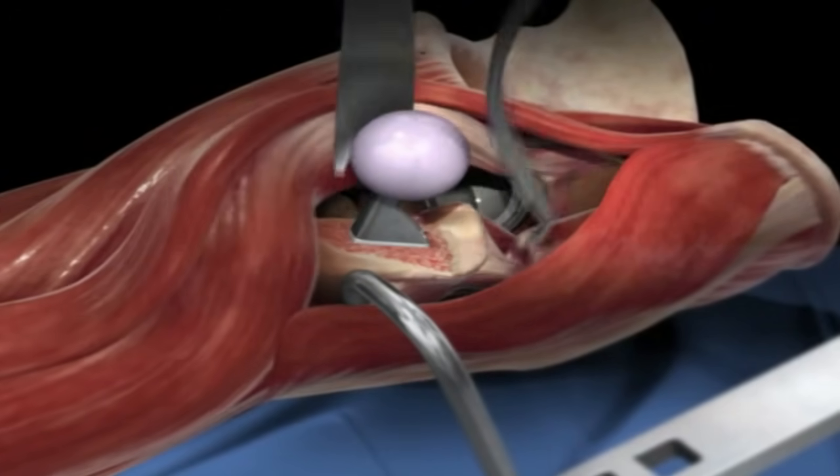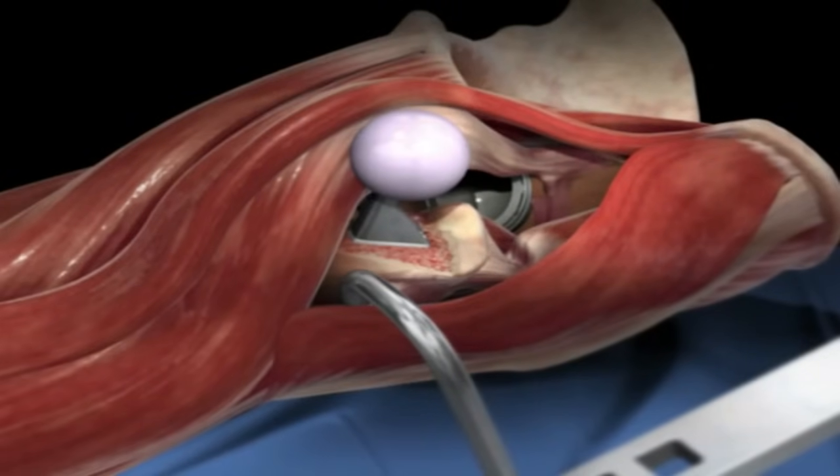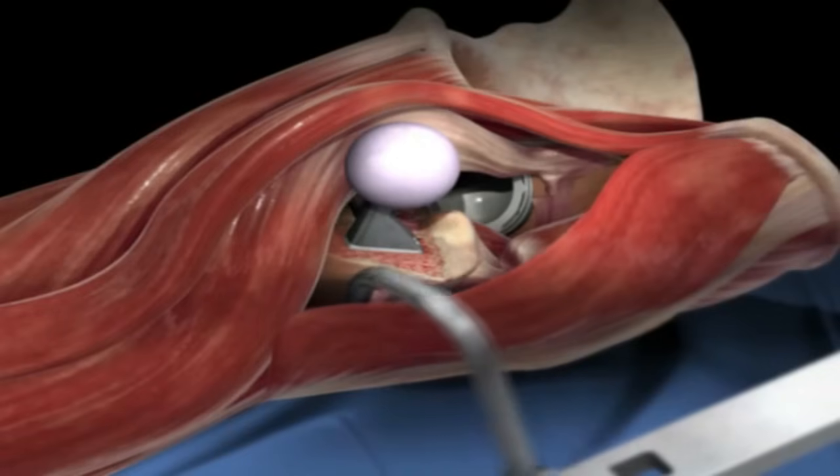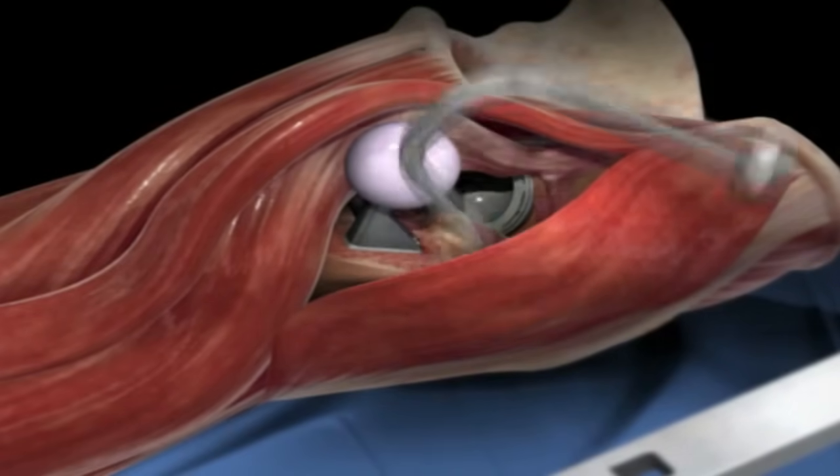The retractors are removed, the ball is placed back into the socket, and then the surgeon closes the wound. The patient is bandaged and taken to the recovery room.